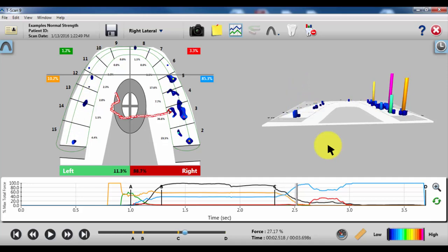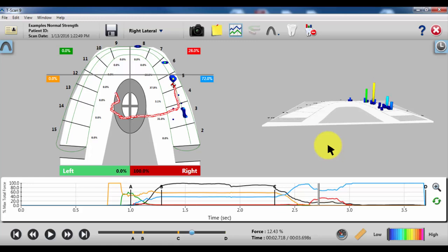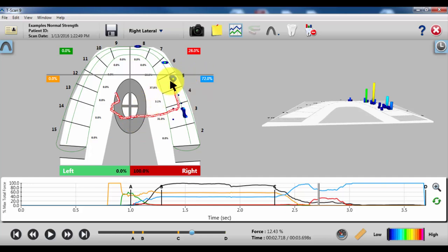Then it looks like it starts to pull up to 5, and so you get some guidance, but very minimal. At this point, I think it's about 20% total guidance. What you're going to look for for an adjustment is to get rid of this space between here and really kind of get this red line to go straight up to number 6.